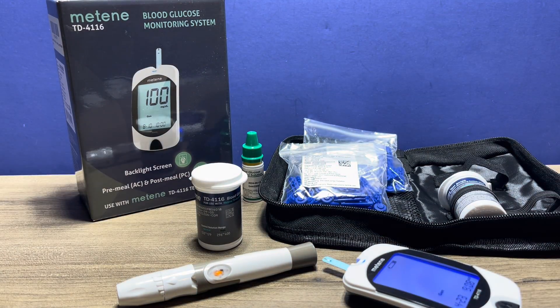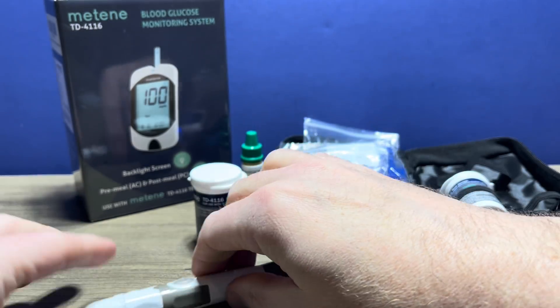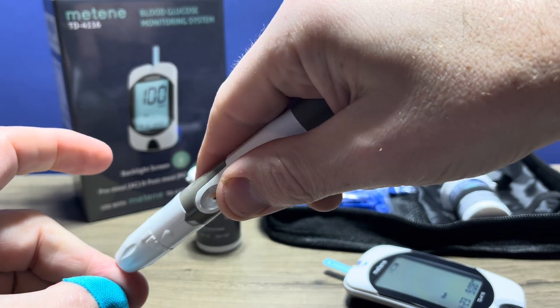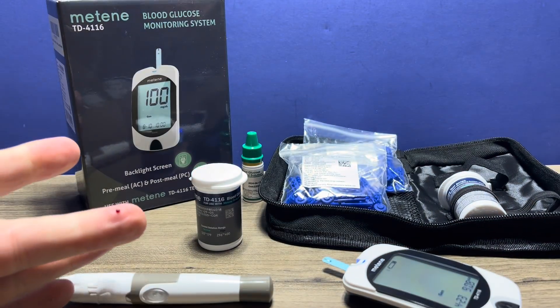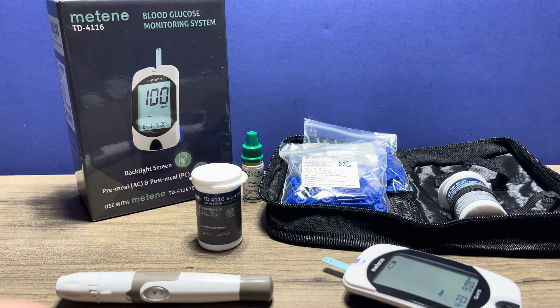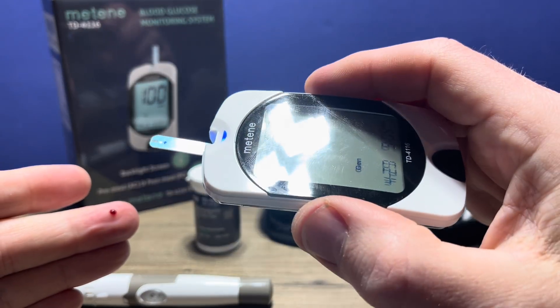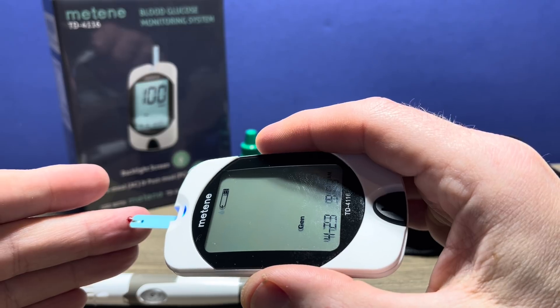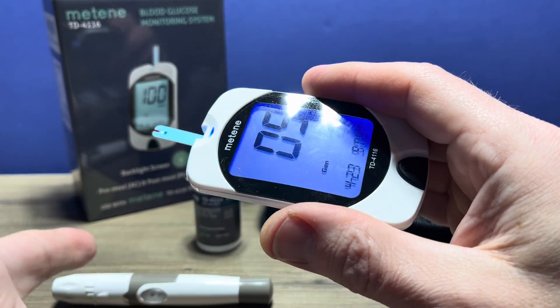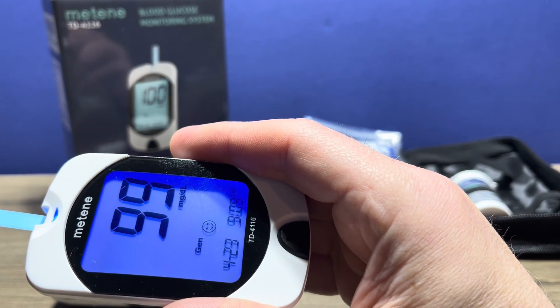So we have our lancet device all ready here. I prefer the side of a finger, and I've already cleaned and prepared the area. They recommend that you use a clean tissue to wipe away the initial drop of blood to prevent any contaminants that may affect the reading. And then once you have that second drop of blood, you go ahead and touch the test strip to it. And there's your reading: 99.